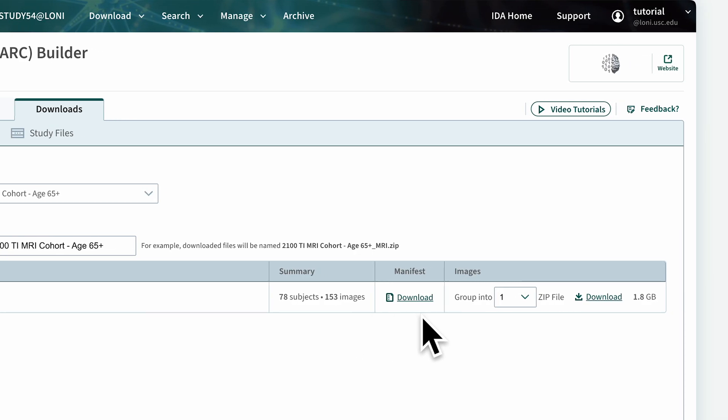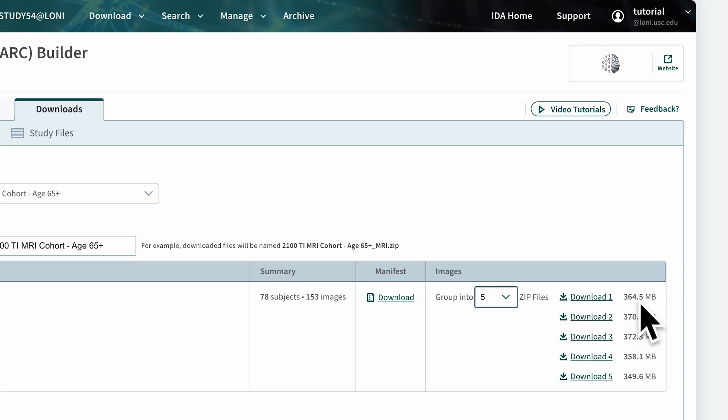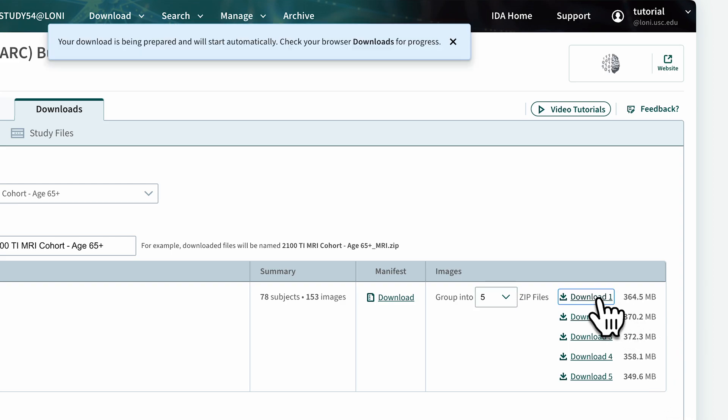A CSV manifest of the images in this cohort is also available. If the zip file of the image scans is large, it can be divided into smaller zip files that can be downloaded at the same time. After you click a download link, the download will automatically start in your browser.